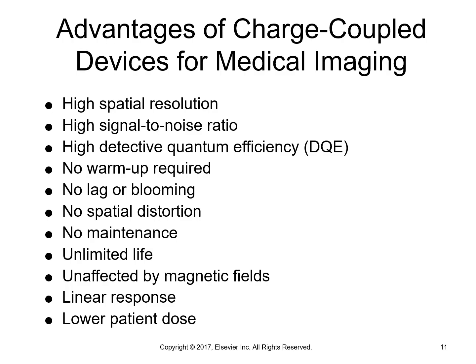All right, let me pause that just a second. All right, so what does a charged coupled device give you? Well, we get a higher spatial resolution. We get a higher signal to noise ratio.